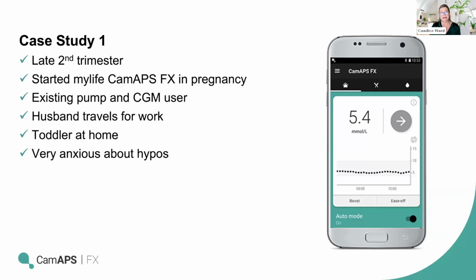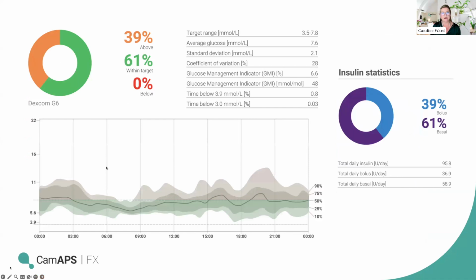This is a lady who was started quite late in her pregnancy with CamAPS. She's an existing pump user and travels a lot. Her husband travels a lot, so she's at home with a toddler and very, very anxious about hypos. And so this is the PDF report.